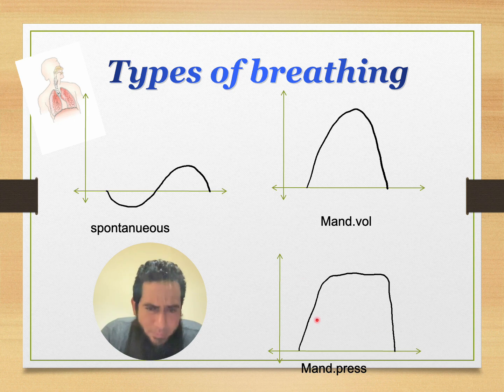The same way with the pressure control. The mandatory pressure controlled breath, the machine will raise the pressure inside the circuit to a certain limit for a certain time, then it will drop off again to the baseline.